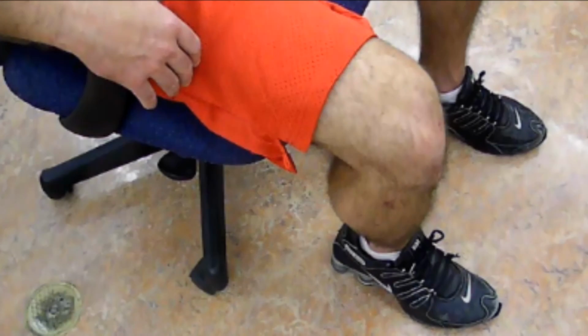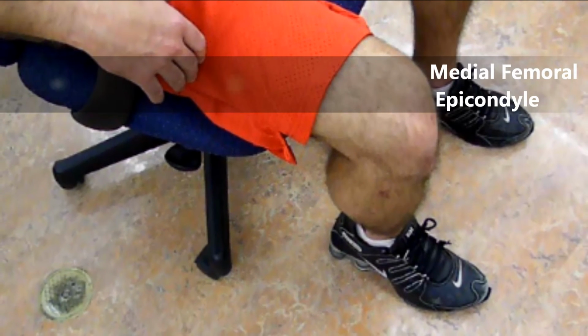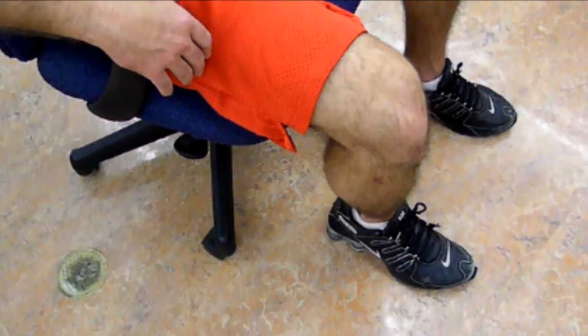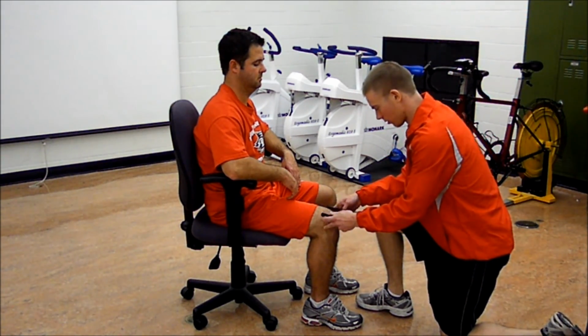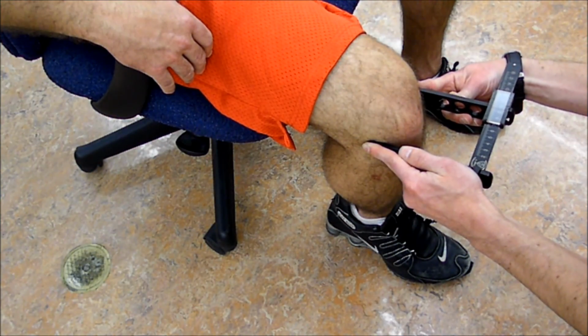The anatomical reference points for the knee skeletal diameter measurement are the femoral epicondyles. With the client seated and the knee flexed to 90 degrees, the technician will apply the caliper tips firmly on the medial and lateral epicondyles.